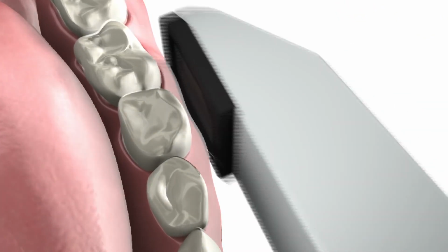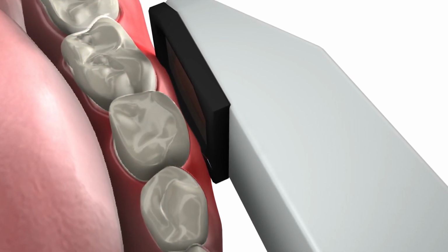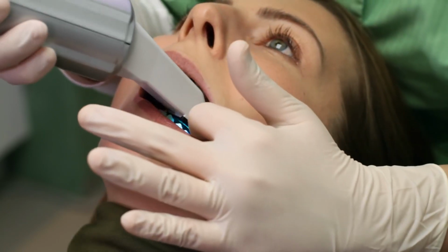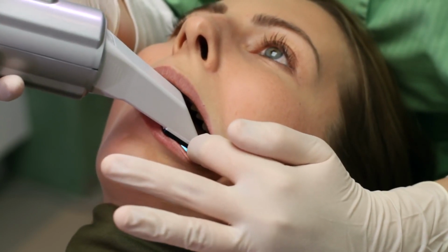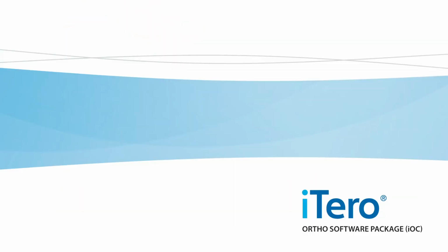When maneuvering, it's very important not to come into contact with the soft tissues, as this may cause discomfort. It's not necessary for the patient to open their mouth very wide. In fact, it's not a problem if the patient bites down lightly on the probe during scanning.